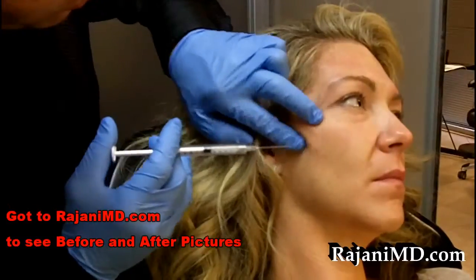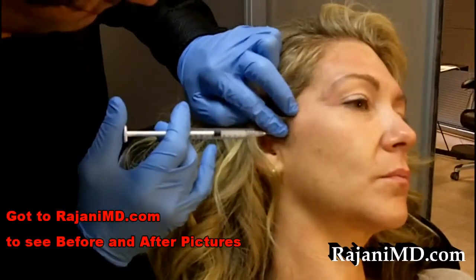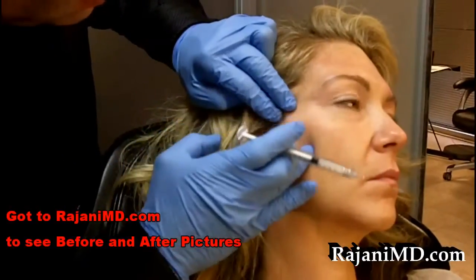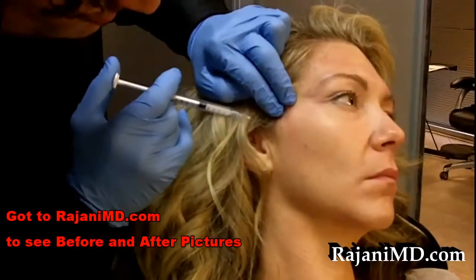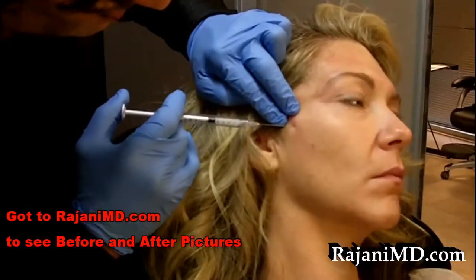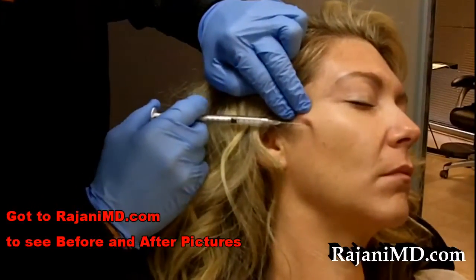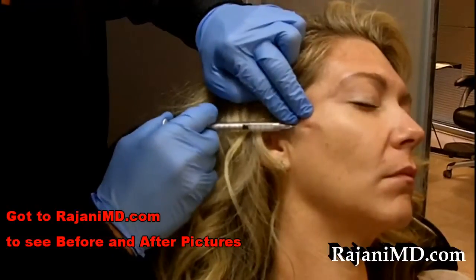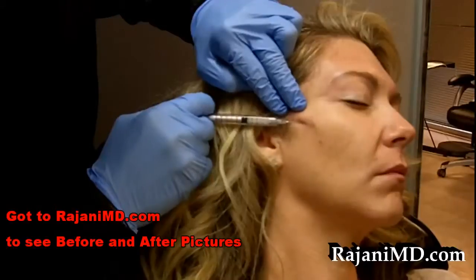Micro cannula technique to augment the high lateral cheek — this is one of the most common areas and patients love this. I'm using the micro cannula, this is a 27 gauge. I'm using Bellafil, and you can use a 25 gauge — most people would prefer that — but if the patient has had other collagen stimulators or surgical procedures done, the 27 gauge cannulates and navigates a little bit easier than the larger 25. The 27 will, however, act a little more like a needle than the 25.